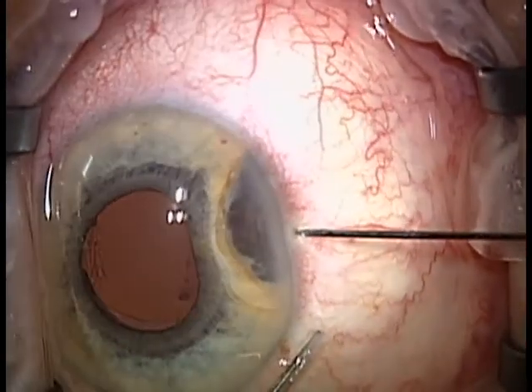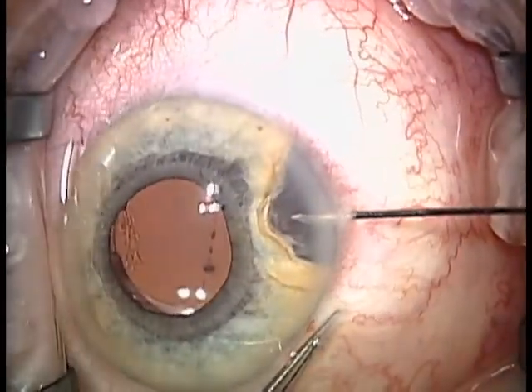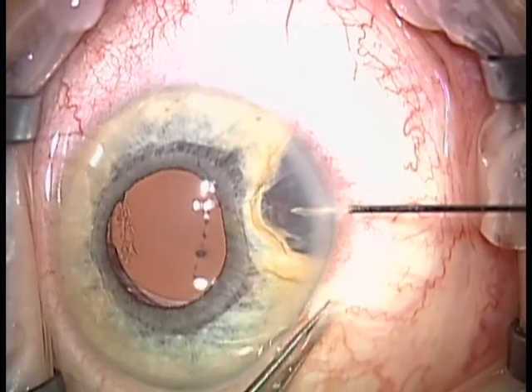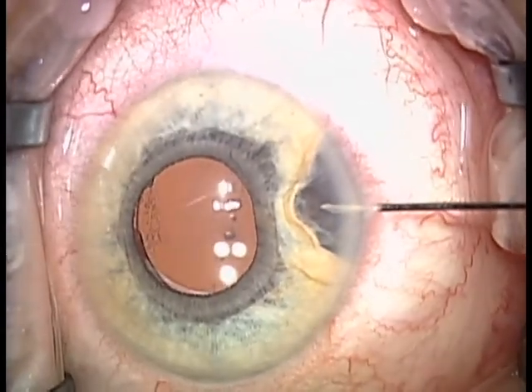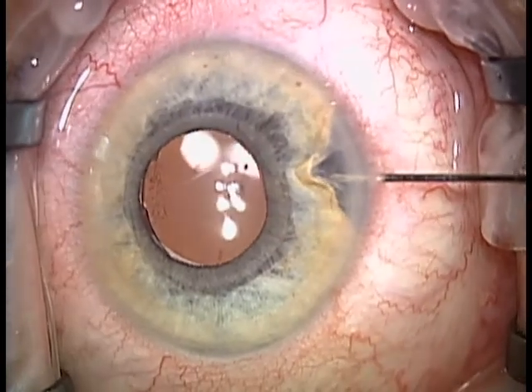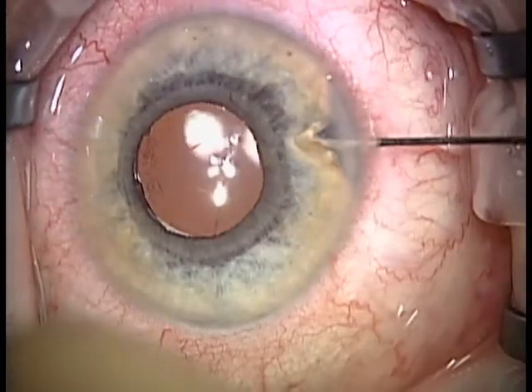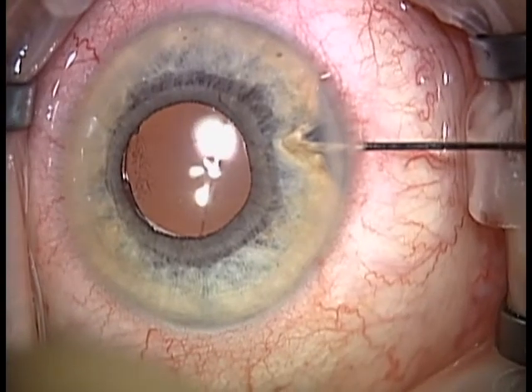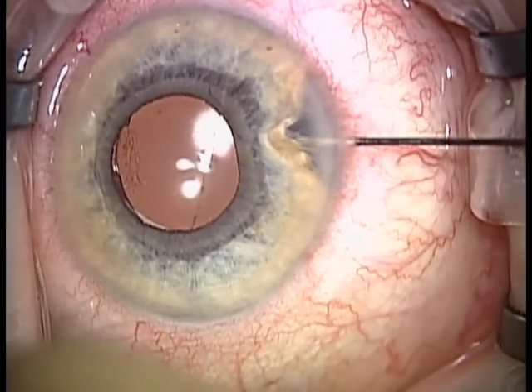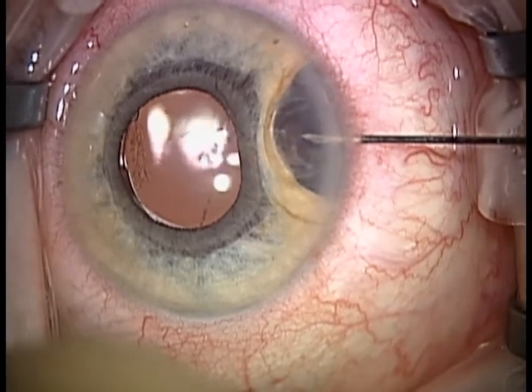The next step is to support the globe and then insert the 30-gauge needle into the interior of the cyst, being very careful not to lacerate the wall of the cyst. The cyst is then gently collapsed as far as safely possible, and the cystic space is then filled with alcohol, being careful not to overfill and rupture the cyst.